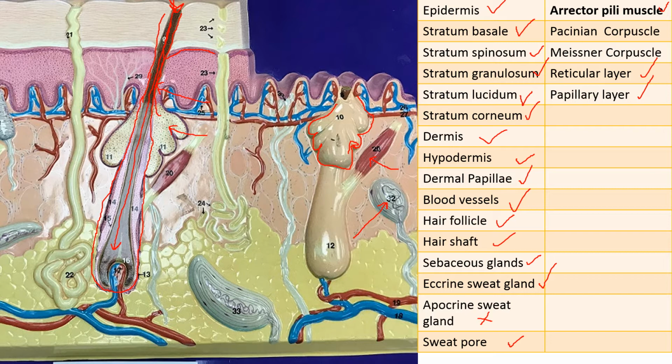And I don't know, lamellated sounds like lamella, which we have in bone, and those correspond to layers. So that helps me remember that these Pacinian corpuscles are lamellated. The other thing I will tell you about them is that they tend to be pretty deep in the dermis, so that'll help you recognize them. Located here at the border between the dermis and the epidermis, we have the Meissner corpuscles. So this is another receptor that detects sensations like pressure and touch. Okay, so hopefully that makes sense.